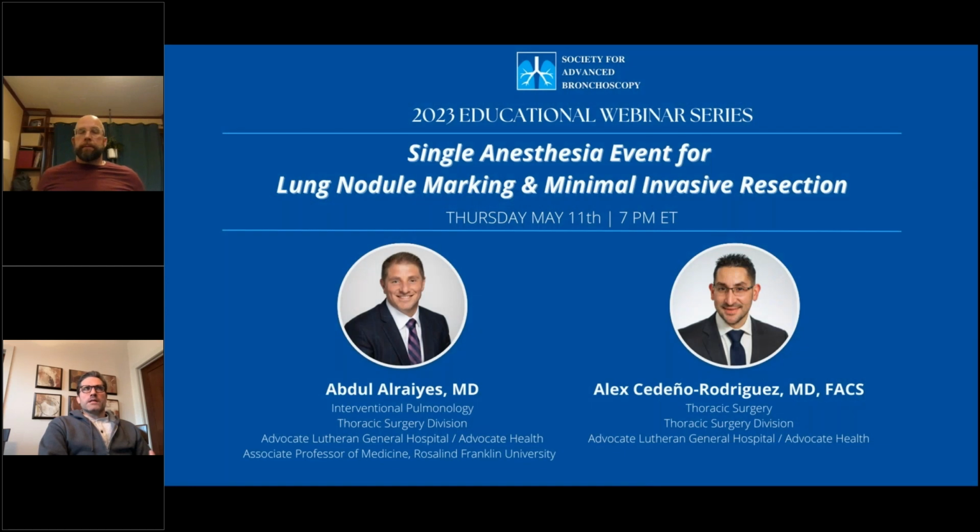The other thing cone beam does not do, as we talked about, unless I'm mistaken, is this: you can position your tool, but if your tool is having deflection, you still don't have the augmented fluoro to say I'm in the right place while I'm biopsying. I do think that is one key component of Body Vision over the other platforms: as you're actually biopsying, you know your tool is in the augmented fluoro, and that's useful.